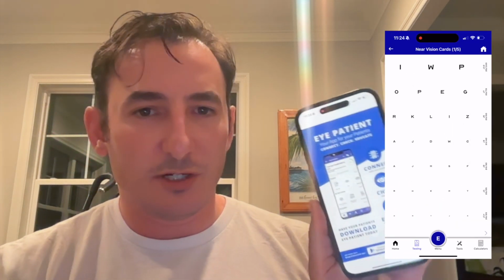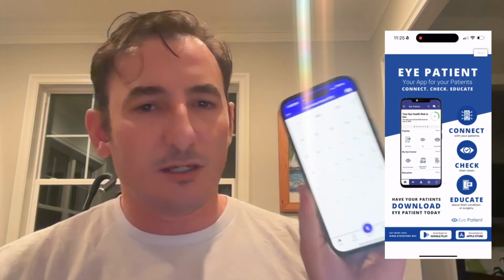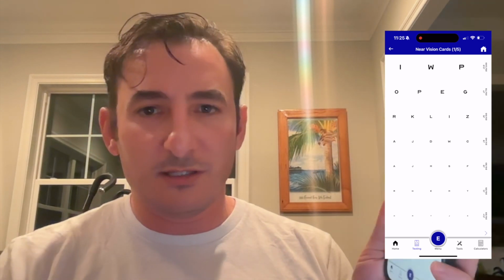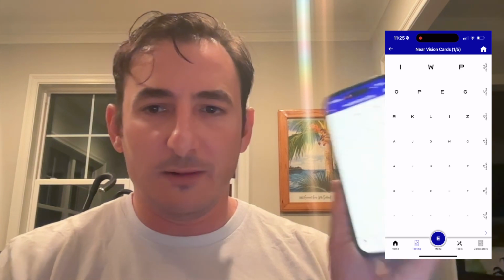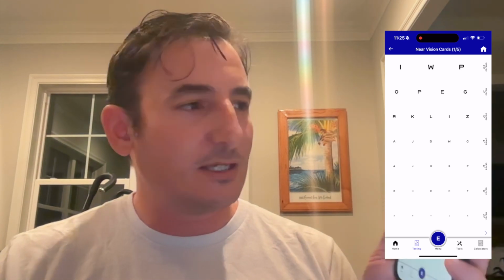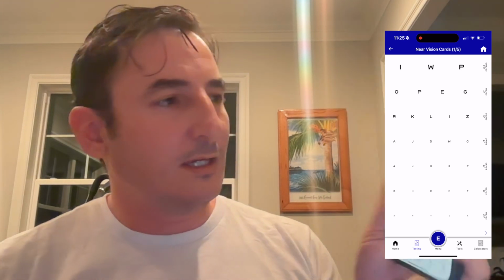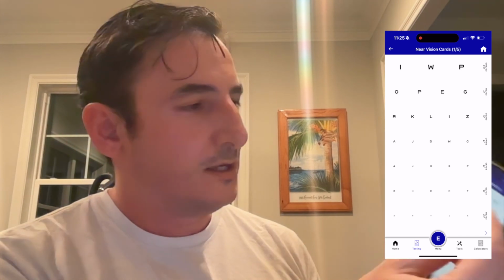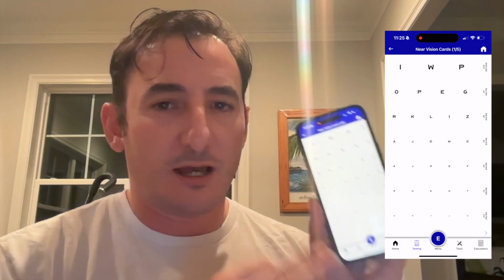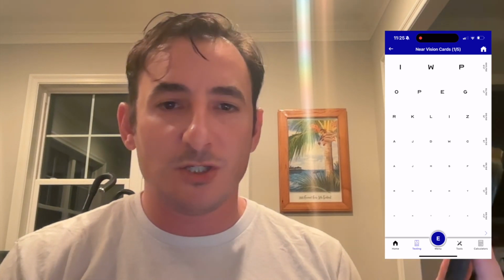But one thing I wanted to draw your attention to when this ad clears here is the accuracy of the test. So I will include a table with the millimeter heights of the optotypes, but just to demonstrate to you here, the Eye Handbook at the 20/100 line, if you take a ruler, this is an iPhone Pro Max, so it can be very different depending on what phone you have. So I would encourage you to test it yourself, see what you get.